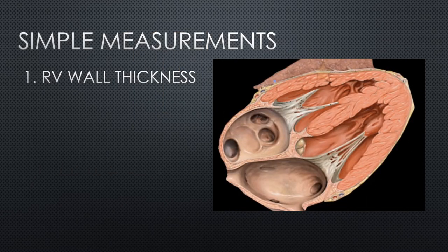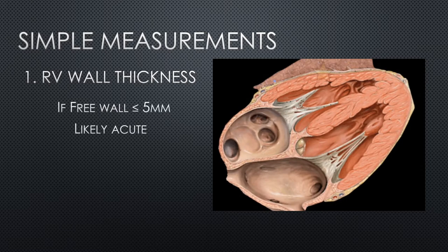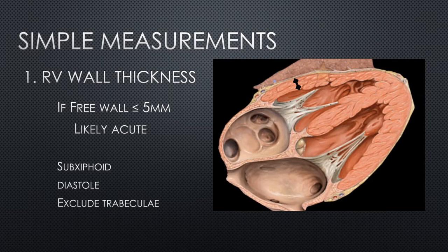Next, two simple measurements. The first is RV wall thickness. If the RV wall is thin, any RV dilation must be acute. However, if the RV wall is thick, it could be chronic disease, or they could have an acute PE on top of chronic disease. The cutoff we use is five millimeters — if the RV wall is five millimeters or less, this is normal and RV dilation is acute. Take the measurement in a sub-xiphoid view during diastole and exclude any trabeculae.